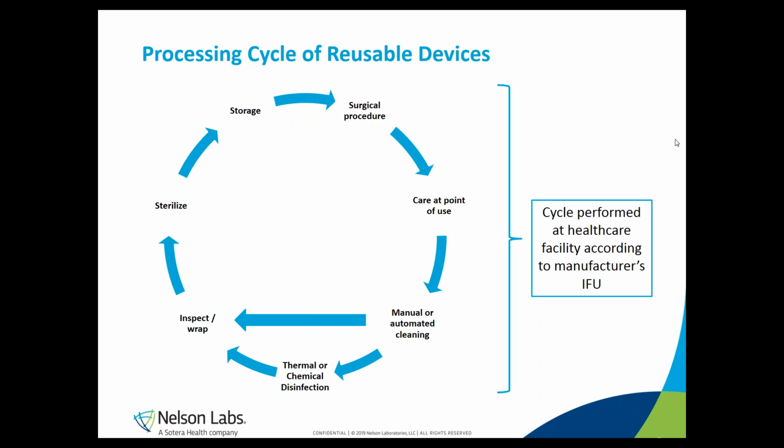After cleaning, a disinfection procedure may be performed. This is mainly dependent on the type of the particular medical device. Cleaning and disinfection procedures are subsequently followed by a visual inspection and wrapping, after which the devices can be sterilized and then stored until next use.